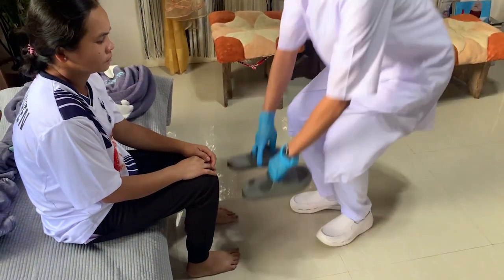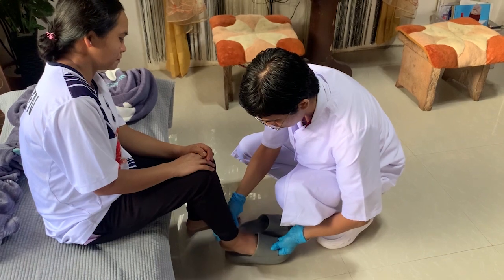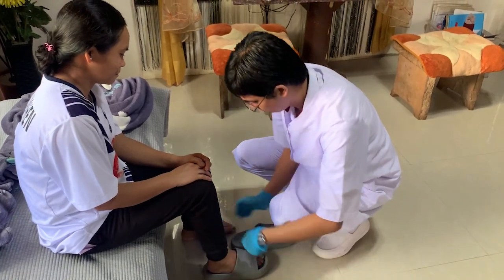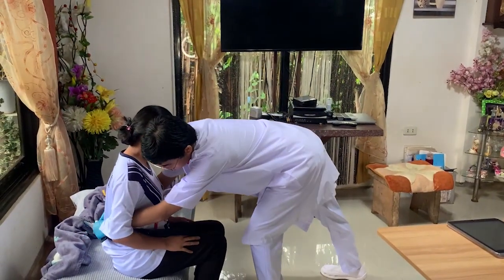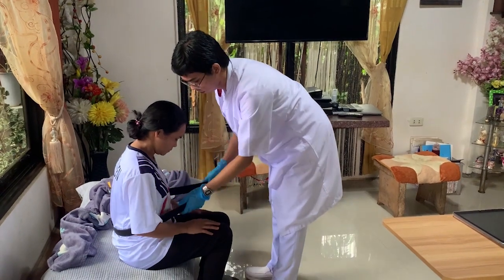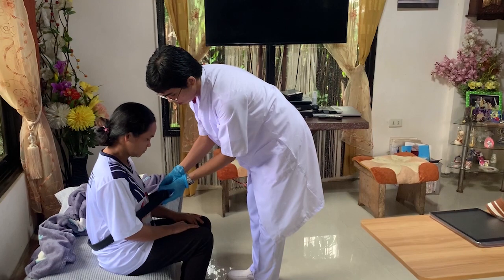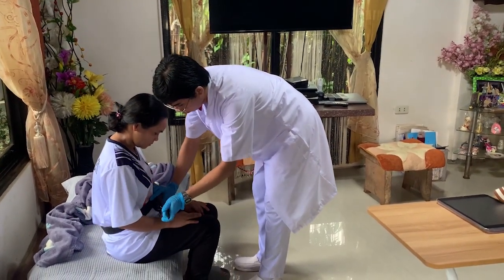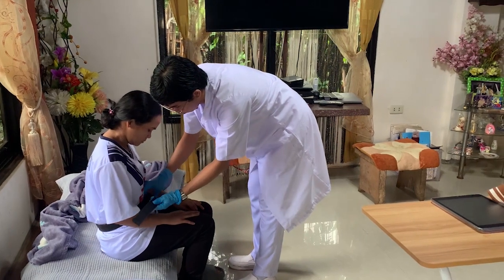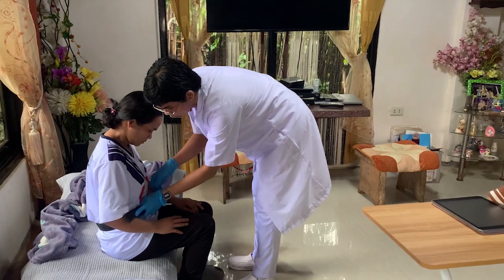Now we're going to assist the client to put on non-skid or slip-resistant footwear. Doing so ensures safety and client warmth. Now apply a gait belt snugly around the client's waist based on assessed need and facility policy. The gait belt improves the caregiver's grasp, reducing the risk of musculoskeletal injury to the staff and also to the client. The belt also provides a firm grasp for the caregiver if the client should lose his or her balance.